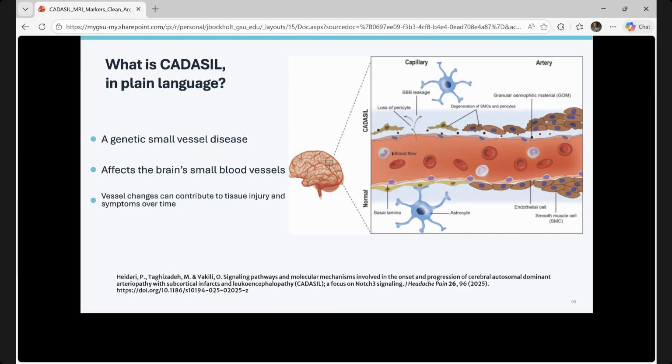So we do get either totals or summaries or even regional summaries for each of these white matter changes, but taken together, or even simplistically totaled or combined, it still really doesn't give you a single score that you can use.